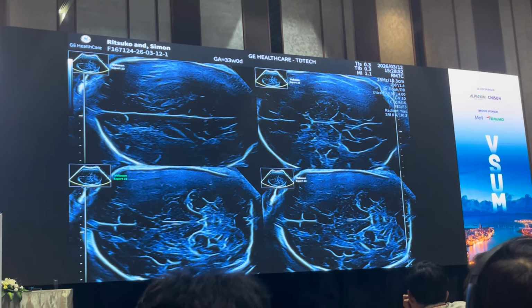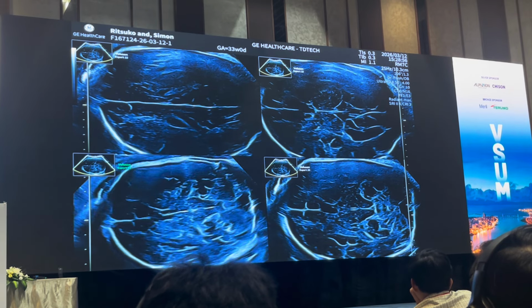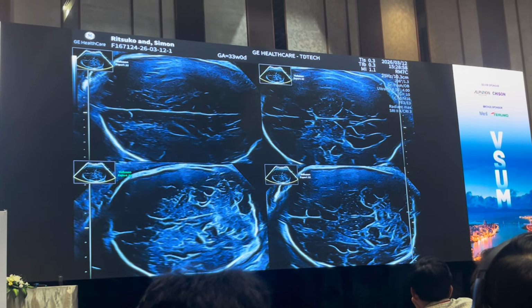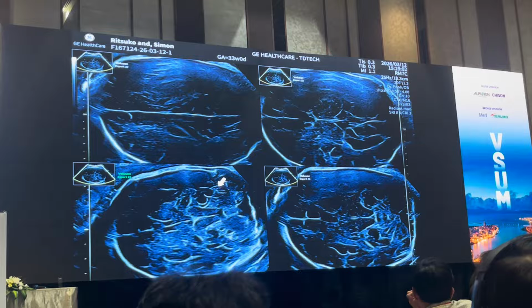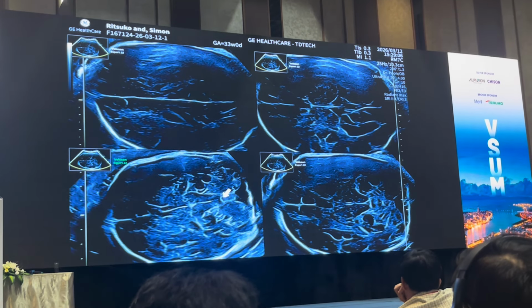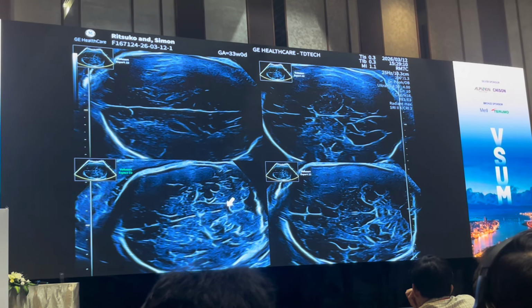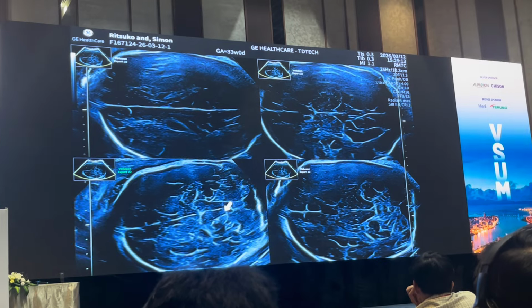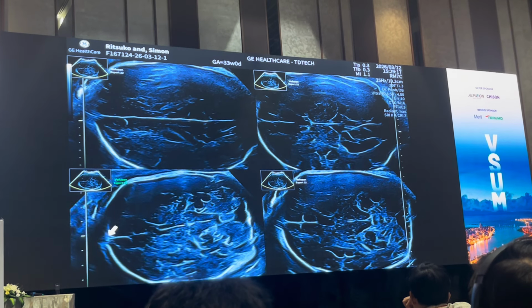For the third measurement, to bring it to view, you will see I rotate my probe, so I come in through the posterior fontanelle to demonstrate the cerebellum. This is the right cerebellar hemisphere. This here is the vermis. This is the left cerebellar hemisphere. This is the roof of the fourth ventricle, which is triangular in shape. And I have my cavum septum pellucidum anteriorly.